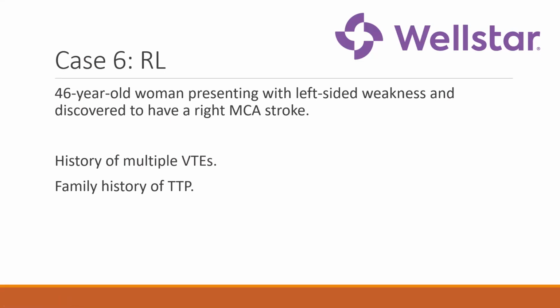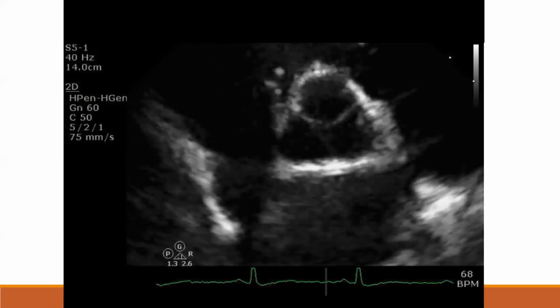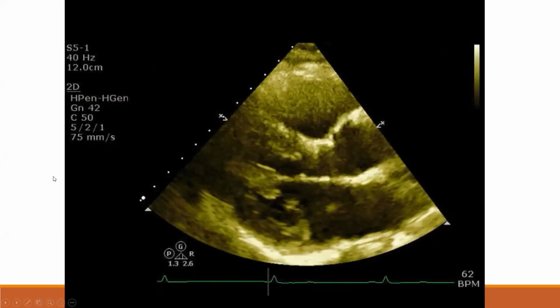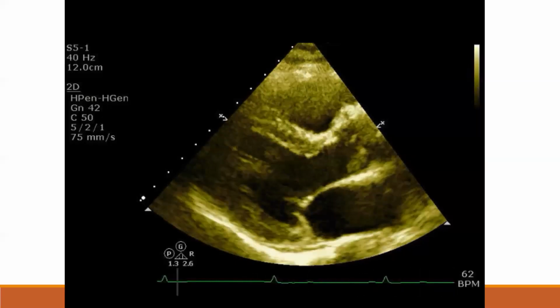Moving on to our next case. This is a 46-year-old lady who presented with left-sided weakness and was discovered to have a right MCA stroke. Interestingly, she has had multiple clots in the past. She wasn't on anticoagulation at this time, and she also has a family history of TTP, which was a little unusual. And here's her short axis view of the aortic valve. You can see one of the cusps has something on it. Looking at it in the parasternal long axis, you can see one of the cusps has, well, it looks like a vegetation.